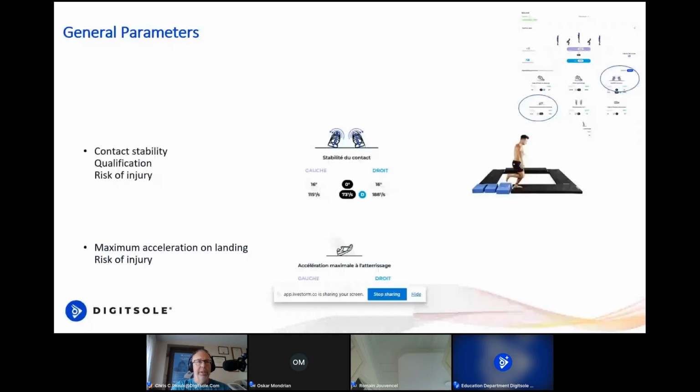I just gave a presentation on running ability, and one of our predictors in running injury, for example, is they slap that foot down and they move way too quickly from heel strike, which typically is going to be in a supinated or heel inverted position, into that pronated position. If they move too rapidly, that's actually considered a predictor for potential running injury, especially if there's a degree of asymmetry. It tells us they have a motor control or a weakness problem. So we're actually able to capture that here with our system.